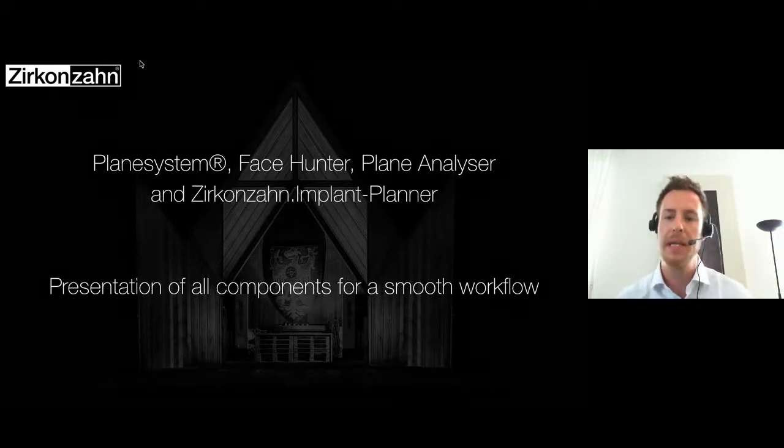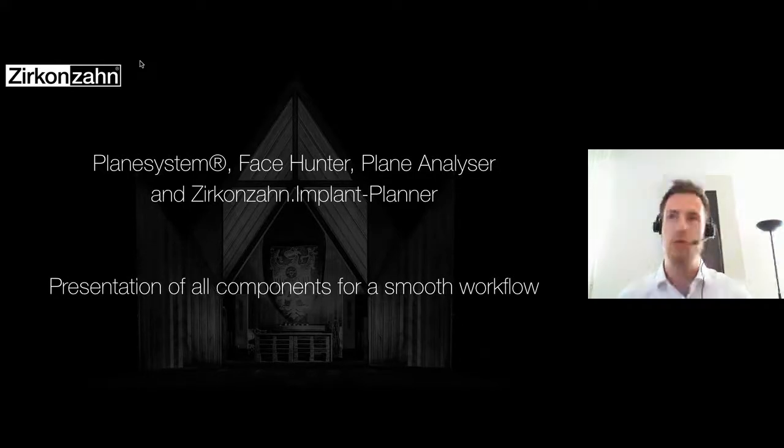It means you are able to receive, with different workflows and different devices, more information about the patient situation to get a better workflow, or to design your restoration in a proper way. Not only an aesthetic, but also a functional result.